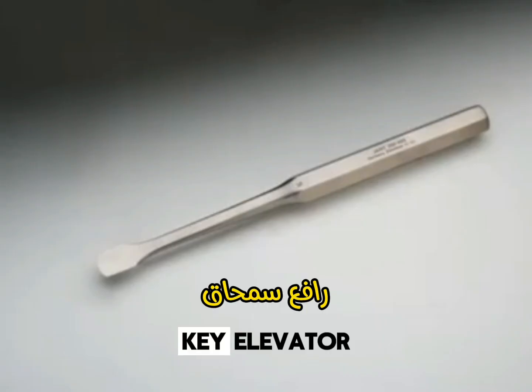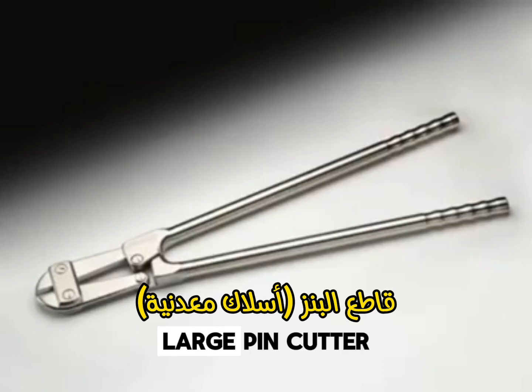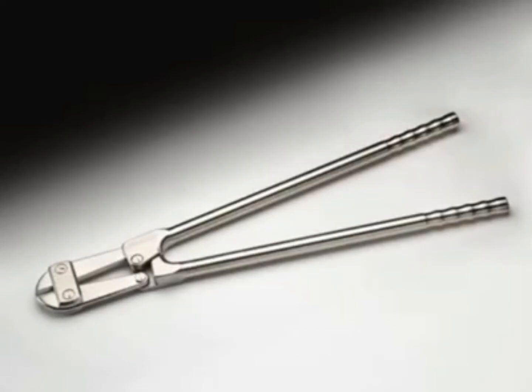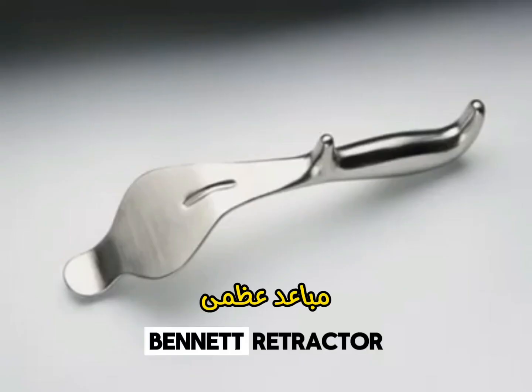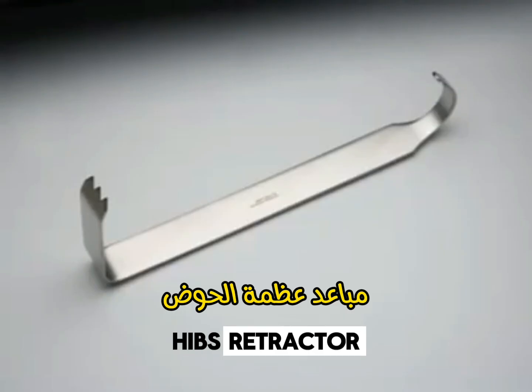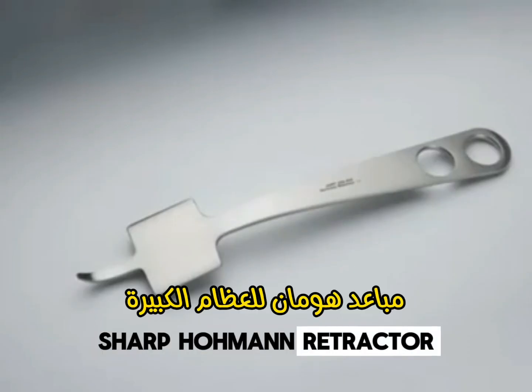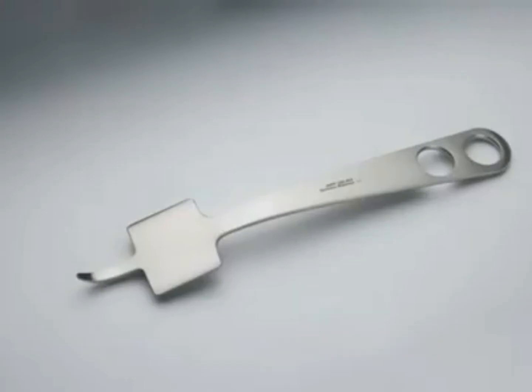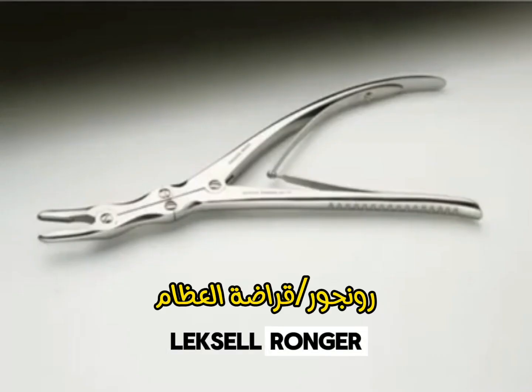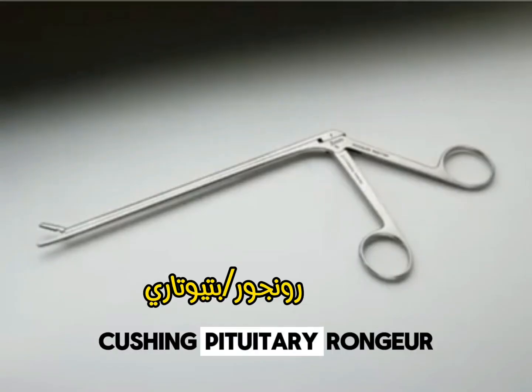Key Elevator. Large Pin Cutter. Bennett Retractor. Hibs Retractor. Bone Hook. Sharp Hohmann Retractor. Lexel Rongeur. Cushing Pituitary Rongeur.